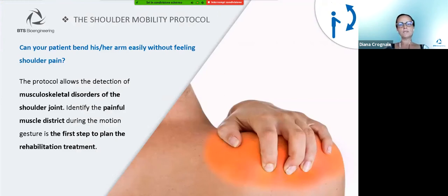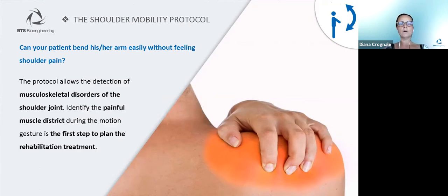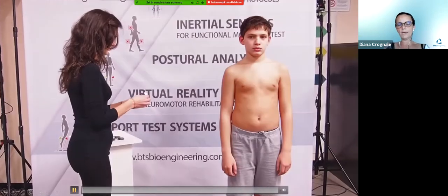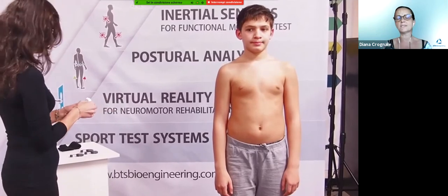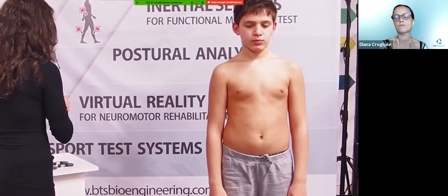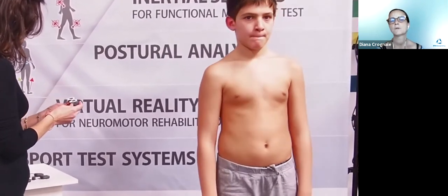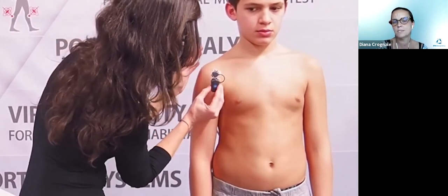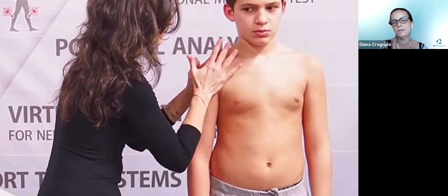The shoulder mobility protocol is dedicated to assessing the patient's capability to perform a flowing and simple flexion, abduction, or rotation movement of the arm, in order to point out the presence of muscular disorders related to shoulder mobility. Based on which movement we need to assess, we go to place four probes on the muscles involved in that specific movement — shoulder flexion, abduction, or rotation. For example, the anterior deltoid is indicated for the assessment of the flexion movement of the shoulder.